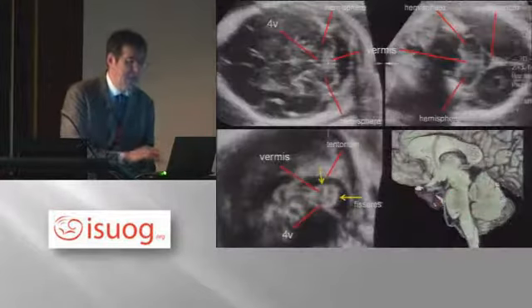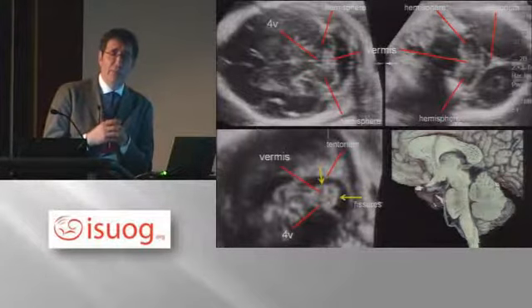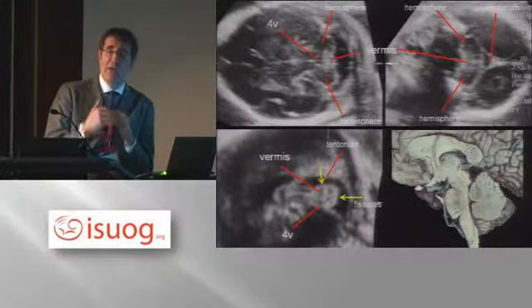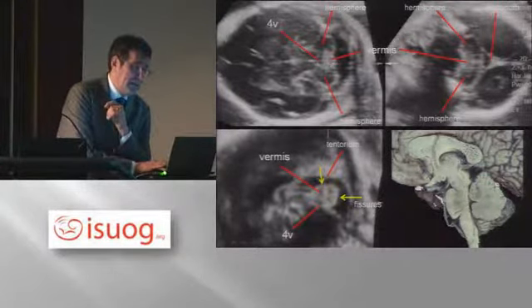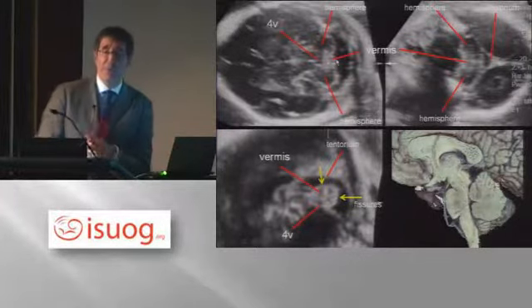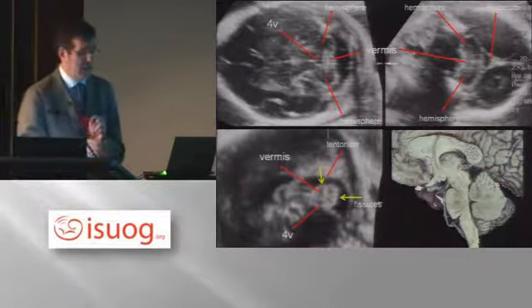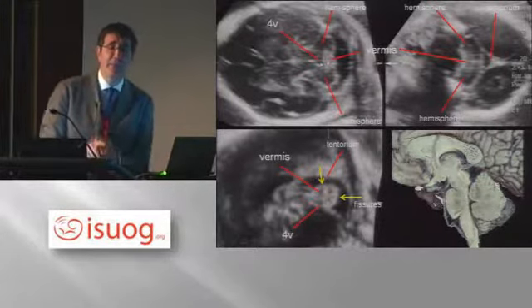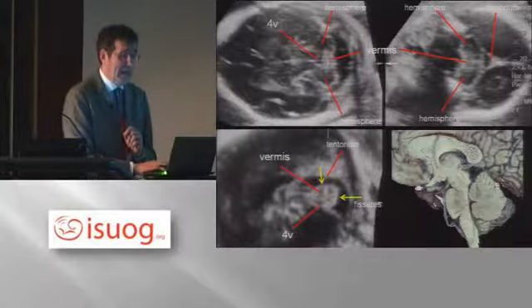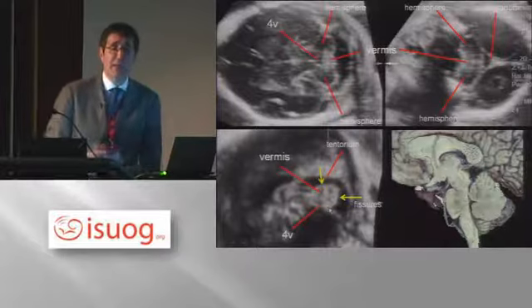Now, what is the advantage? The advantage is that when you are using three-dimensional ultrasound in the multiplanar mode, you exactly know where you're placing your section plane. Because this marker dot tells me that the section plane in this plane exactly corresponds to the cerebellar vermis. So this, as you can see, is an ideal representation of the posterior fossa, because I have simultaneously an axial plane that tells me that the vermis is present, and I can cut along the vermis and see how it appears in the sagittal plane.